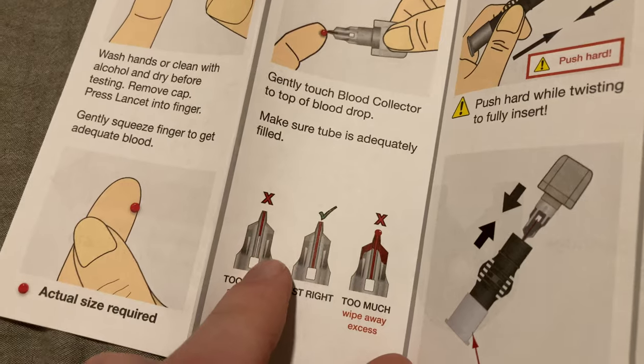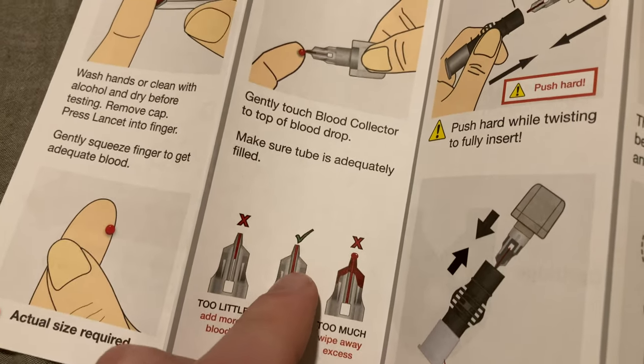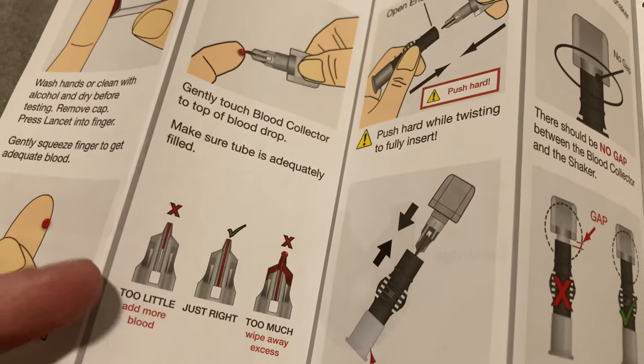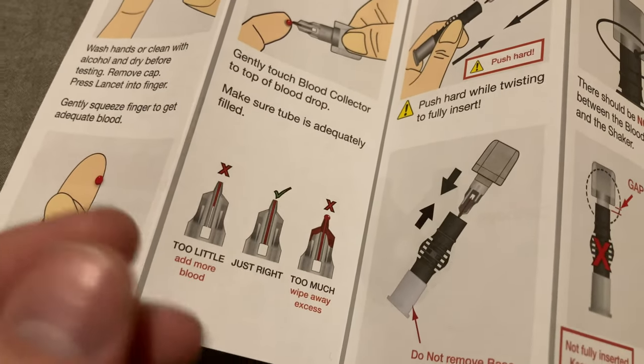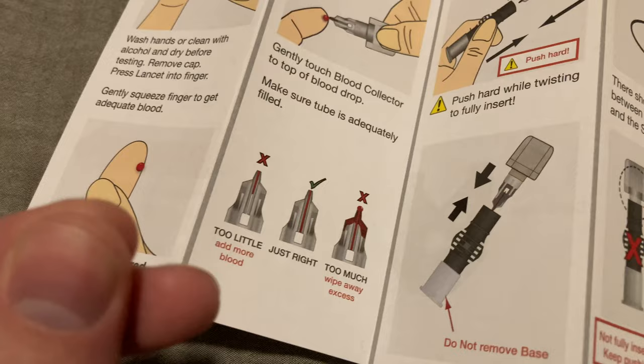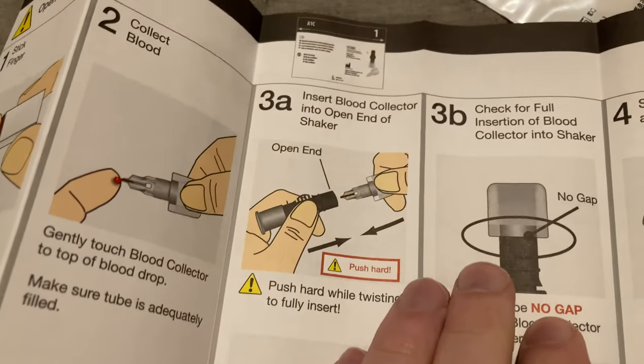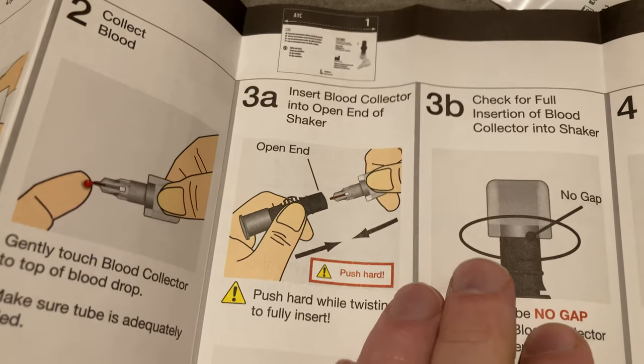The correct amount is like this. As soon as the capillary fills, just pull it away from your finger. If you still have blood coming out of your finger, put a little tissue with some pressure from another finger and hold it until it coagulates and stops bleeding. All right. Next, you're going to insert the collector into the open end.